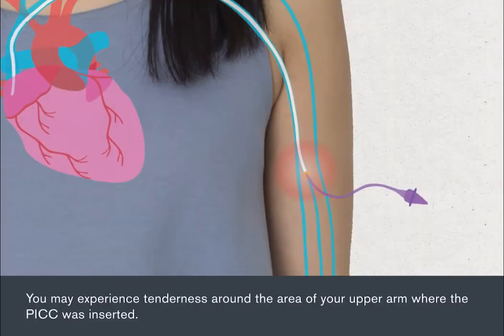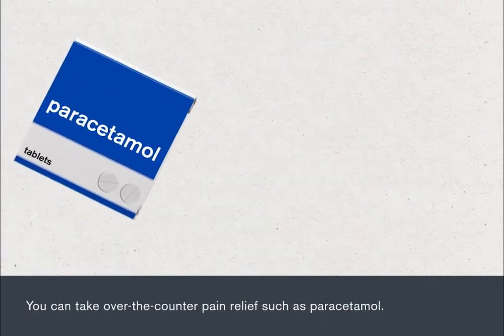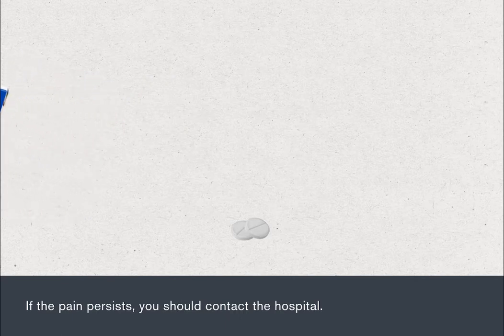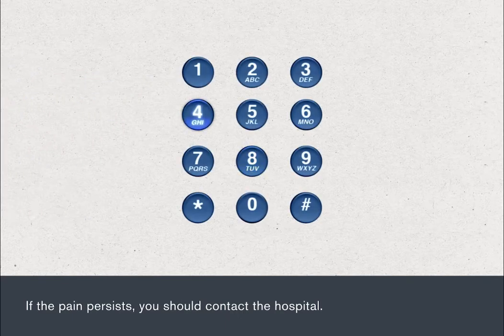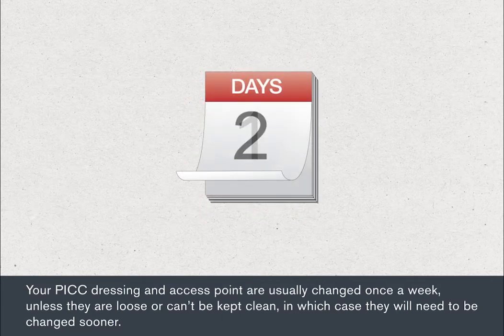You may experience tenderness around the area of your upper arm where the PICC was inserted. This is most common in the first week after the insertion. You can take over-the-counter pain relief, such as paracetamol. If the pain persists, you should contact the hospital. Your PICC dressing and access point are usually changed once a week, unless they're loose or can't be kept clean, in which case they'll need to be changed sooner.